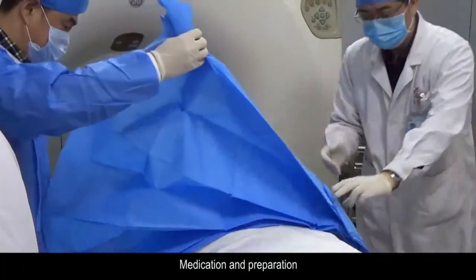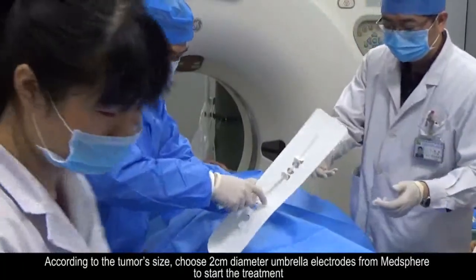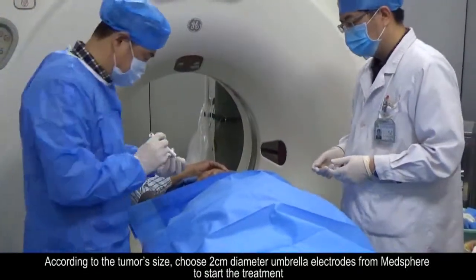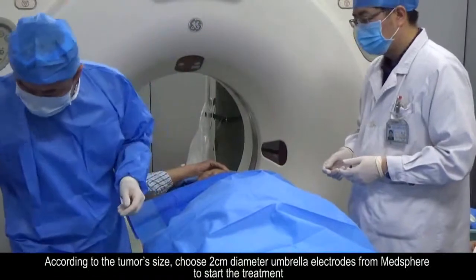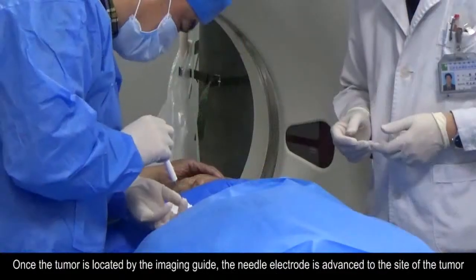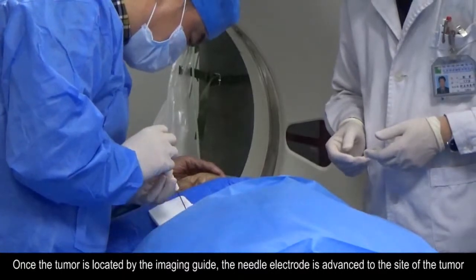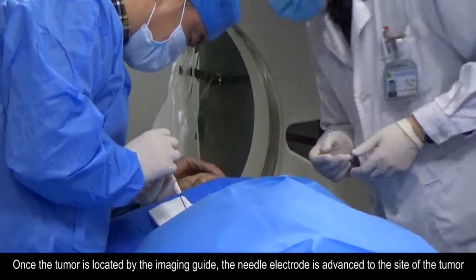Following medication and preparation, according to the tumor's size, choose two-centimeter diameter umbrella electrodes from Med Sphere to start the treatment. Once the tumor is located by the imaging guide, the needle electrode is advanced to the site of the tumor.